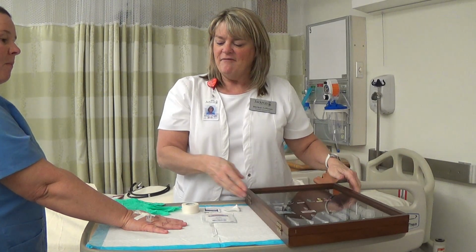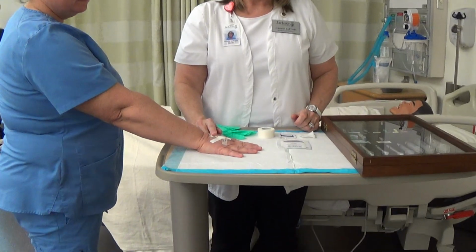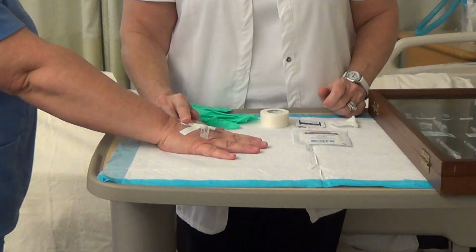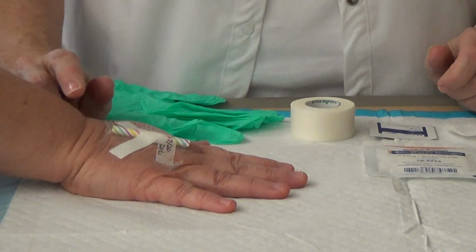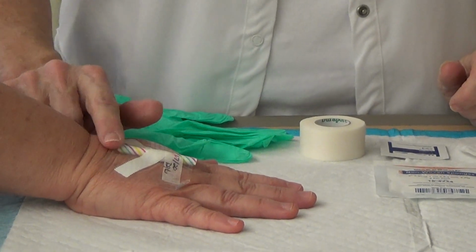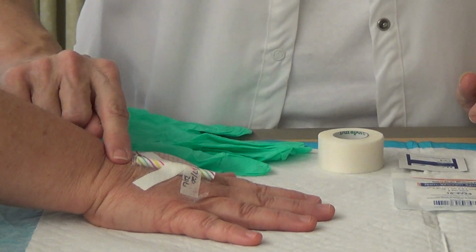Okay, so I have my model here, and she has her IV site in, and she's going home, so we're going to discontinue this IV site. Now when you're assessing an IV site, you want to look for any redness, swelling, pain, so you'd ask the patient, and then also just observe for any redness or swelling around the insertion site. This is the insertion site.